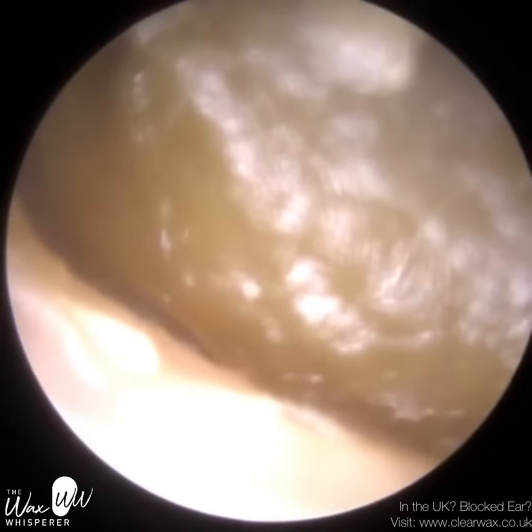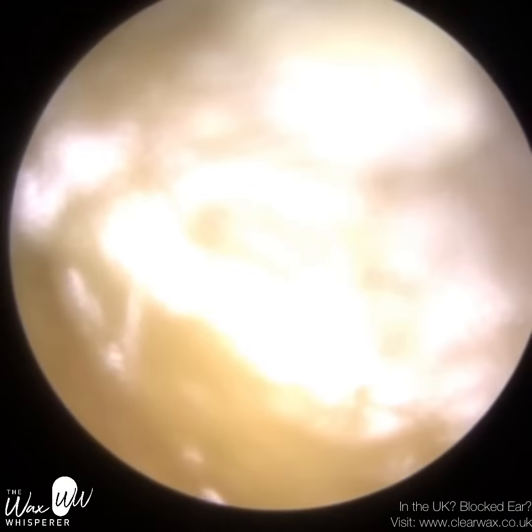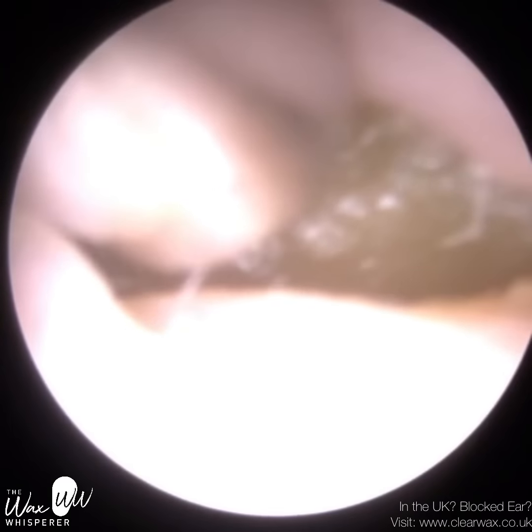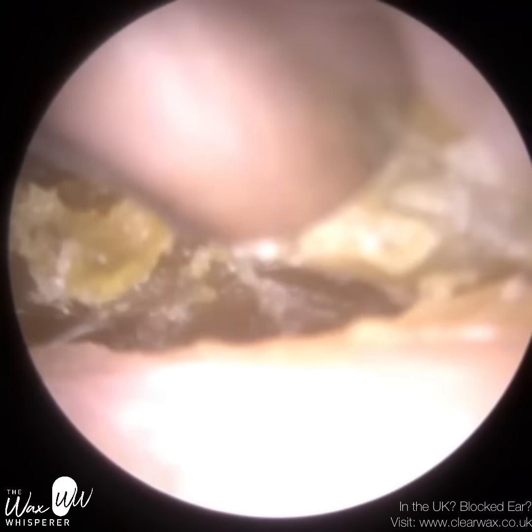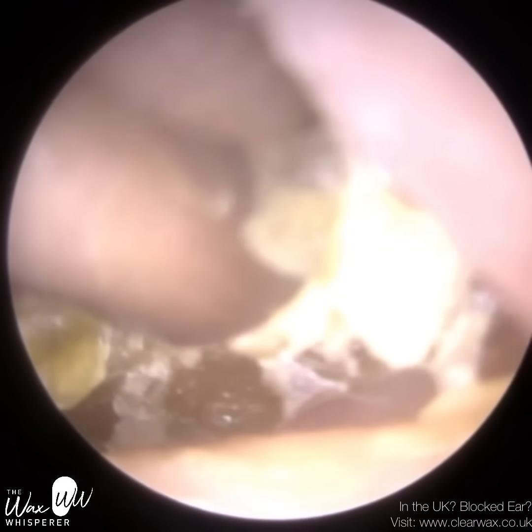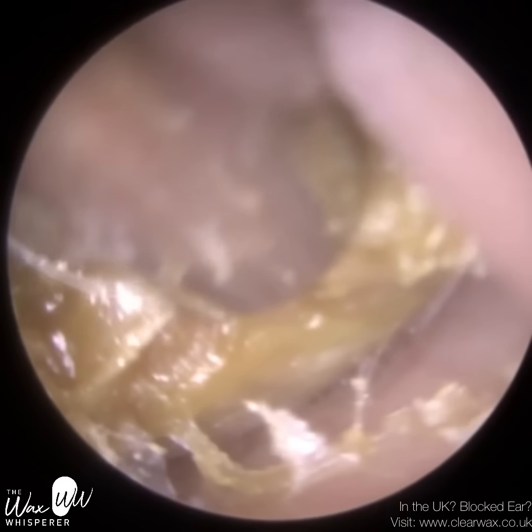This is of a patient who primarily attended because of their right ear, and you'll see that after we remove the wax from their left ear. But just to give you an inclination of what's involved in the right ear, and I think the title of the video somewhat gives it away, in their right ear they had a really small pinhole perforation, so the hole in the eardrum, and that was due to a middle ear infection.